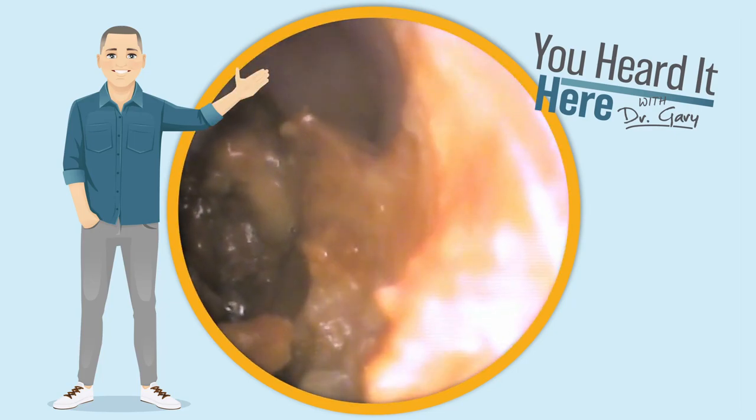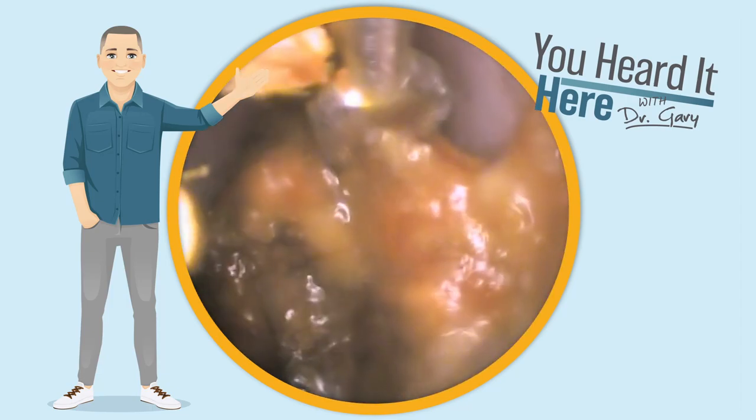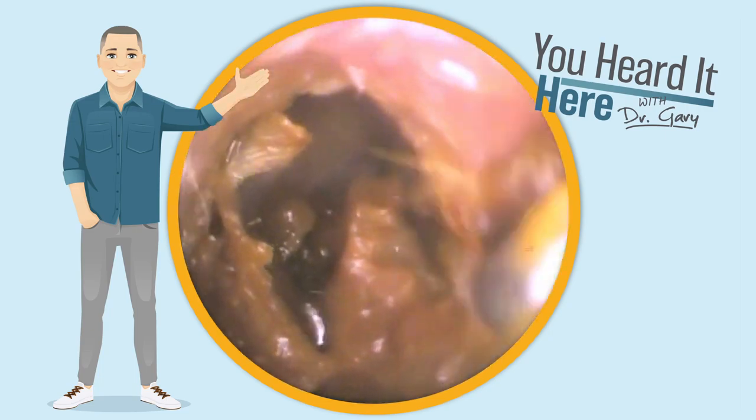Now we're going to use the curette to get on top of that wax. While we're doing that, let's do a little 'Did You Know.' Last time we did one about shooting — this time we're going to do it about concerts.